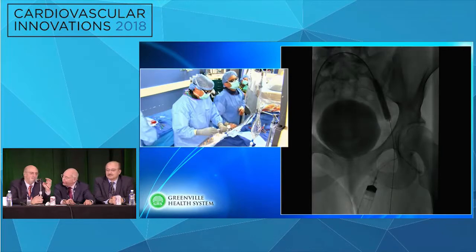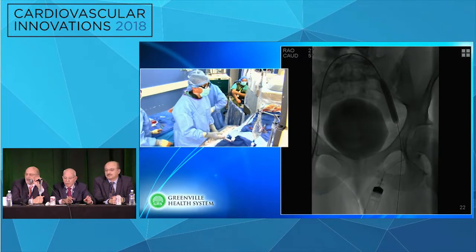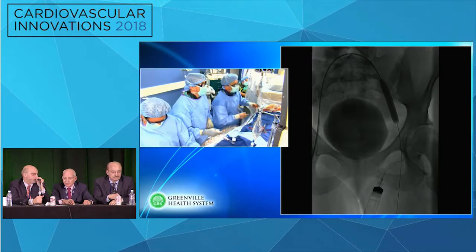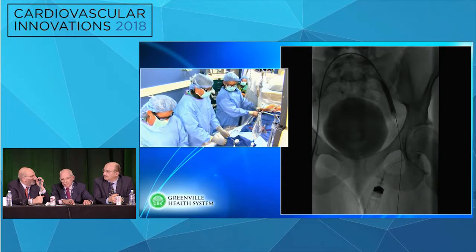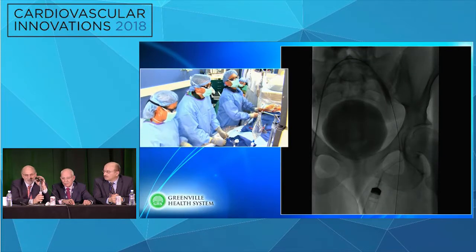I think you're then hanging struts into the lumen, and it doesn't matter. Mike says, so what? But I think, so what if you put it into the IVC and get good apposition? You can go through the struts of a wall stent and spread it. It's a woven stent. I just don't see the downside.